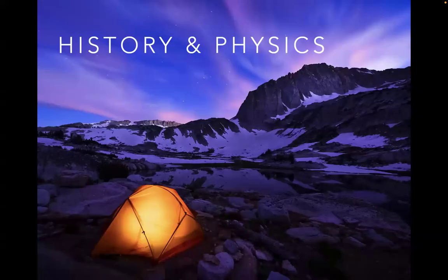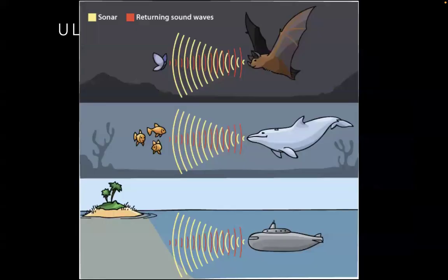So let's talk about the history and physics of point of care ultrasound, because it is very important to know about the physics portion of things before we even talk about how to do the actual scan. Point of care ultrasound is kind of similar to echolocation and sound waves, as you can see in all three of these examples.